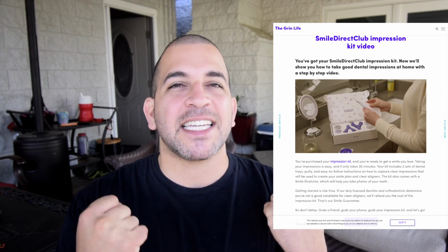Now at Smile Direct Club, they offer two options. One where you go to the Smile Shop where you work with a trained team of impression takers, and the other option is the option where you do it at home. But what I personally have issue with is the taking of the impression of yourself at home. Smile Direct Club gives you an impression kit and they tell you step by step how to take that impression, but I personally feel like it won't be as accurate as possible.